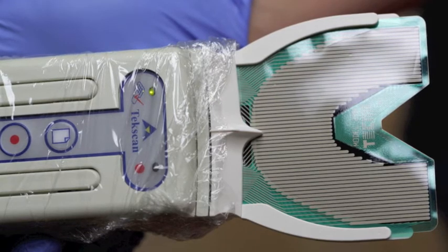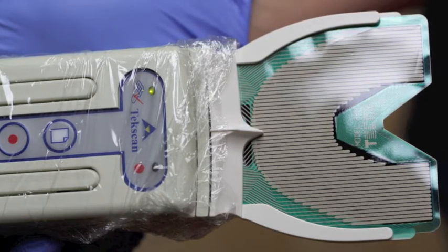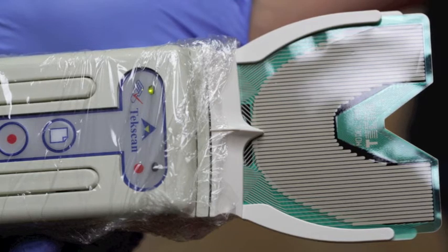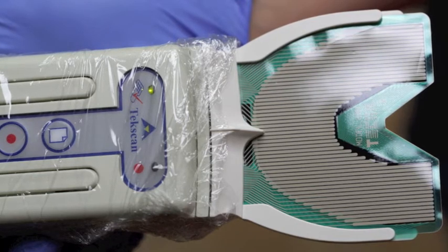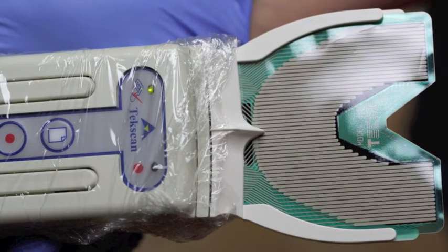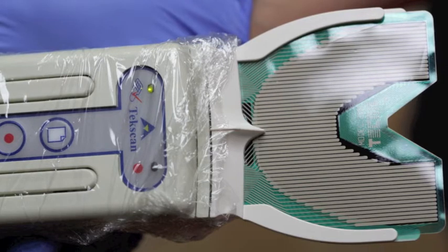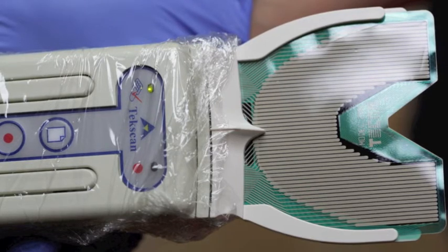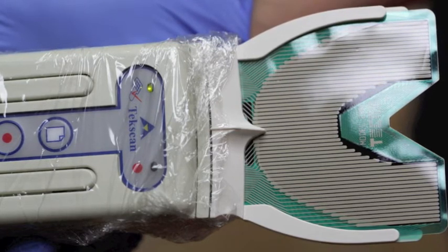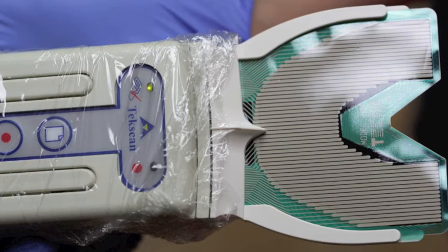The T-scan handle and sensor actually measures the force generated over time as the patient bites into the sensor and mimics chewing strokes, allowing the dentist to study the data — identifying exactly where and when problems may lie in the bite — an infinite improvement over just the ribbon itself.